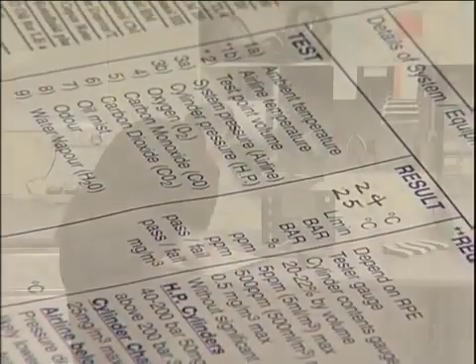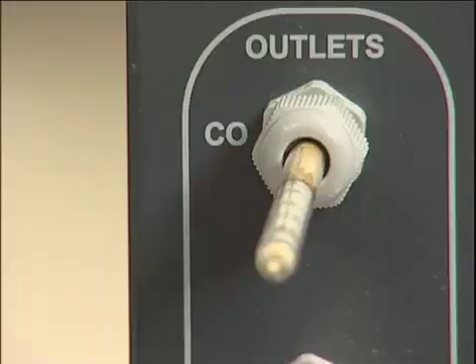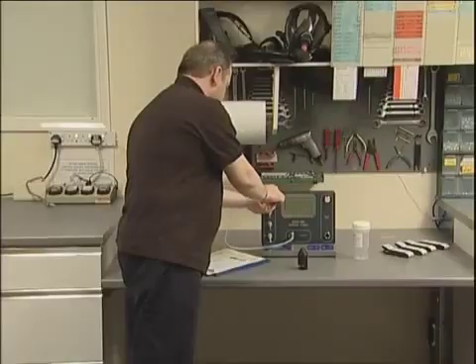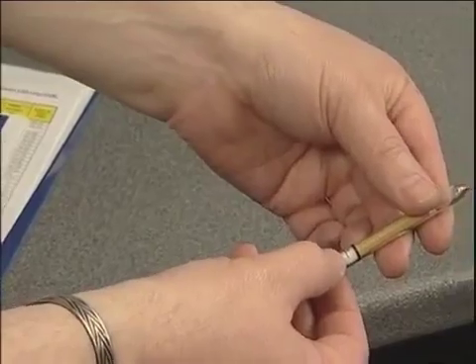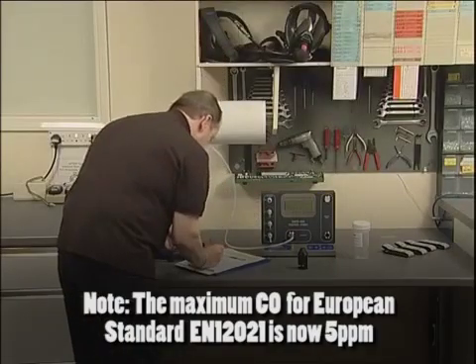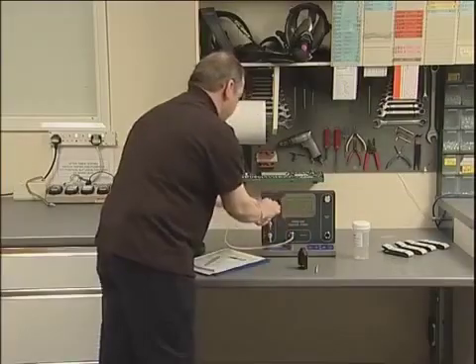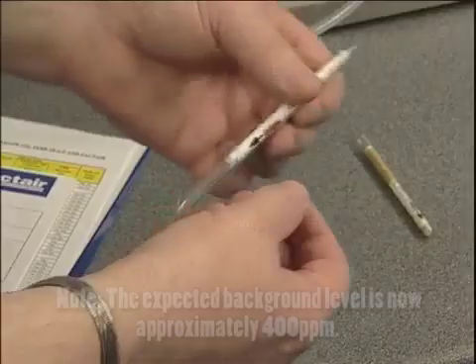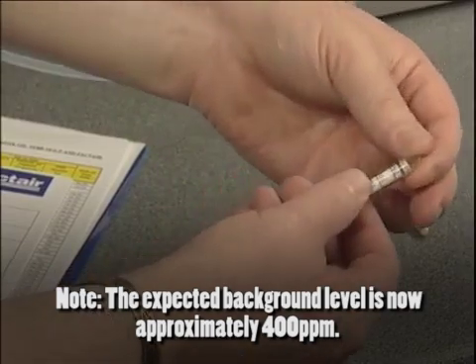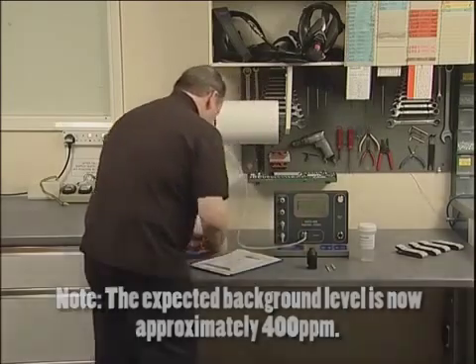Instructions on reading detector tubes and their safe disposal can be found in the documentation wallet. If the test sample contained carbon monoxide, a greyish stain will be present at the start of the white crystals on the CO tube. The extent of this must not be greater than 5 parts per million for the UK and 15 parts per million for the European standard EN12021. A maximum carbon dioxide level of 500 parts per million is permissible in breathing air. The expected background level is approximately 380 parts per million and this will be represented as a purple stain at the start of the CO2 tube.